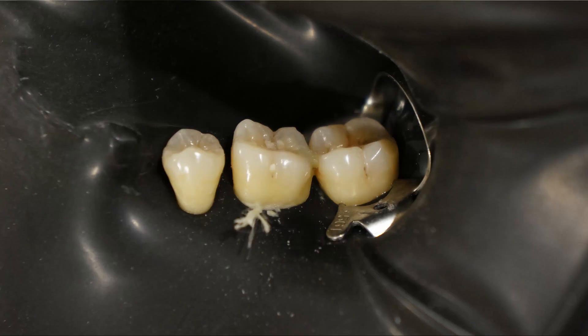One of the biggest advantages of this clamp is that it is a very active clamp. It has a kind of sawtooth pattern on its beaks, which makes it very retentive. Especially when used with certain thick gauge rubber dam sheets, the posterior part of the clamp does not lift off the tooth — it stays exactly where I place it and does not lift off because of the tension applied by the rubber dam sheet.